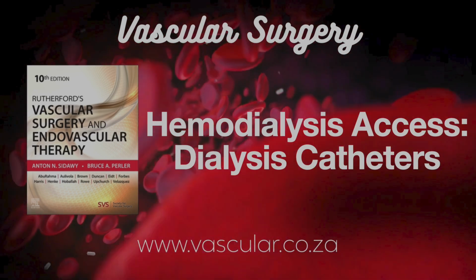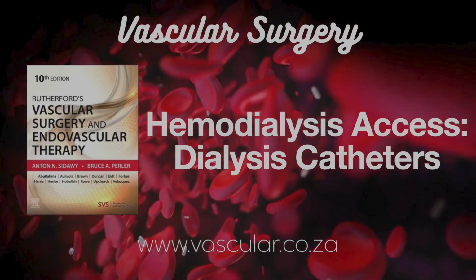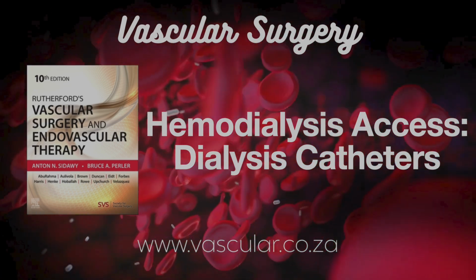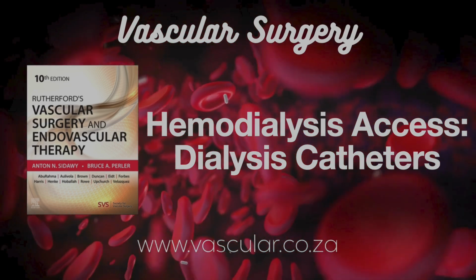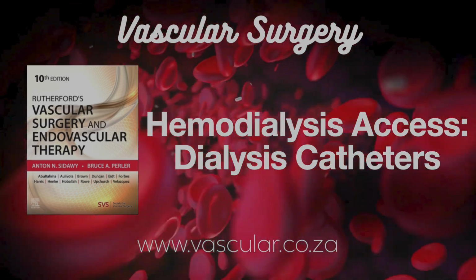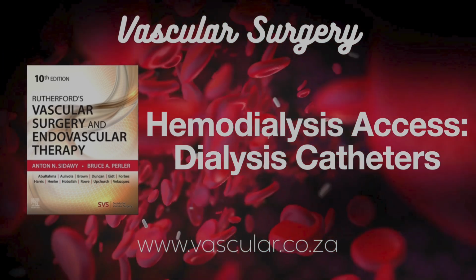Absolutely essential. And then navigating that whole range of potential complications, both immediate ones like pneumothorax or misplacement, and the long-term issues like occlusion, thrombosis, stenosis, and of course infection, plus how we manage all of that. Understanding all these pieces is just vital for anyone caring for dialysis patients. No question. It really impacts patient outcomes and their quality of life.